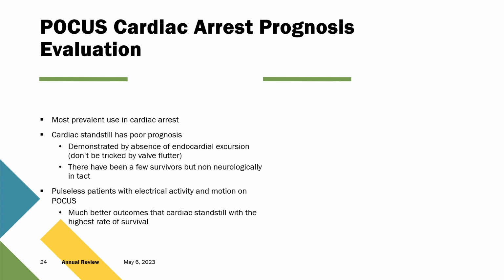However, pulseless patients with electrical activity and motion, whether it be very, very minor motion on ultrasound, have fared much better. And so knowing this simple finding would help a physician determine whether to continue with CPR in a particular instance or not.